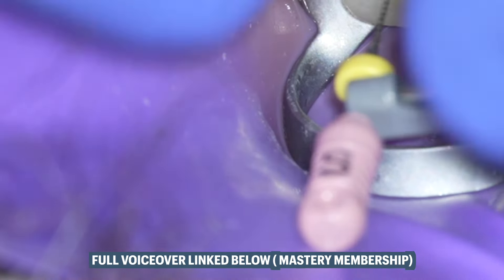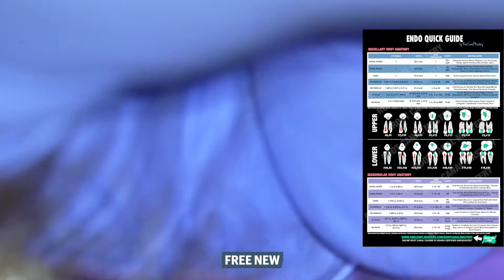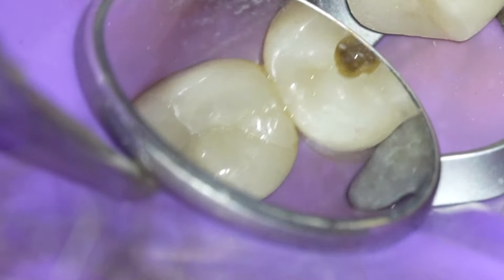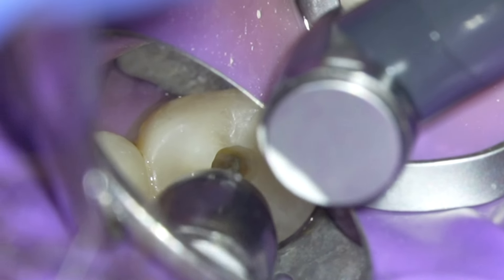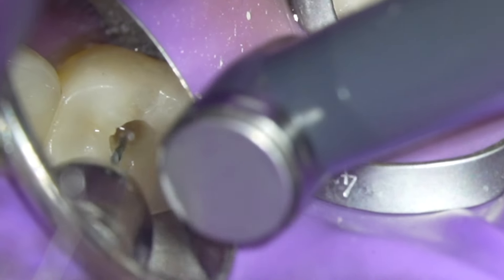I started with a size 6 file because this tooth was calcified. I went to scout with a small file, and that's exactly what we did here. We scouted with a very small size 6 file just to get the feel of the canal. I could feel that it was very tight along the full length, so throughout the instrument changes I'll be more careful and not rush to the apex right away.